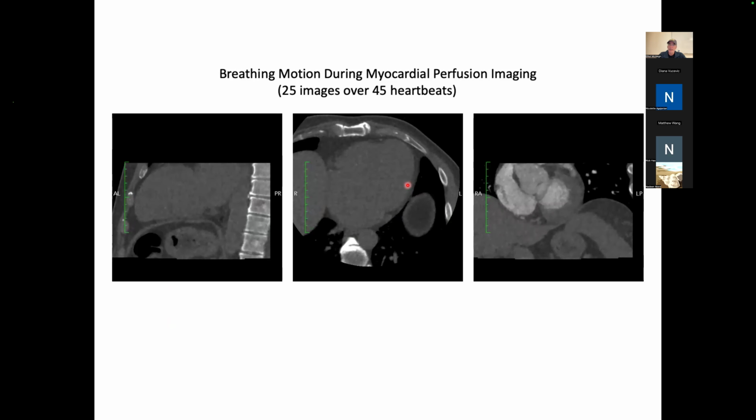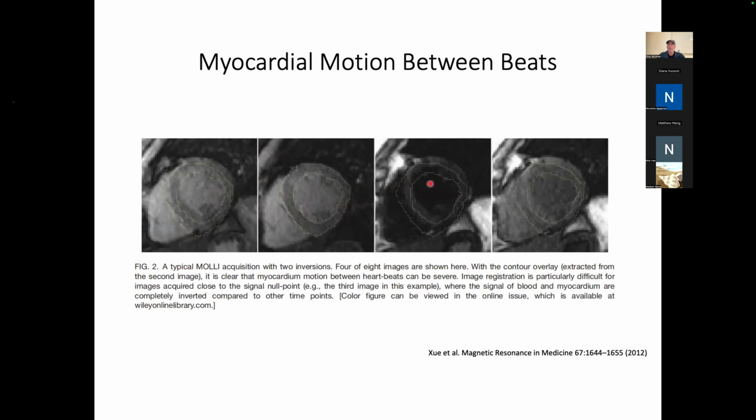So if in MR we're doing these quantitative imaging sequences in one single plane, you look at essentially one of the segmentations of the myocardium and then map that segmentation on other views, and then the heart just doesn't overlap everywhere. So it makes it a challenge.